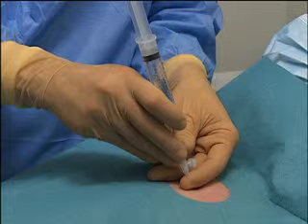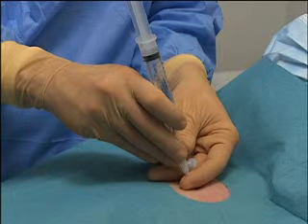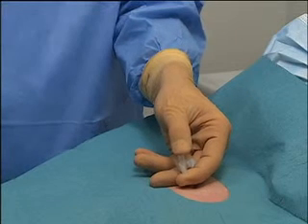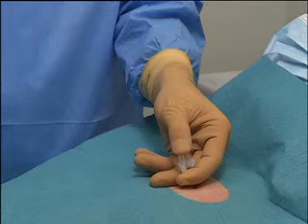Ask the patient to exhale or cough to prevent air from being sucked into the pleural cavity. Remove both the catheter needle and the 10 ml syringe. Immediately cover the opening of the catheter with your finger to prevent the entry of additional air into the pleural cavity.